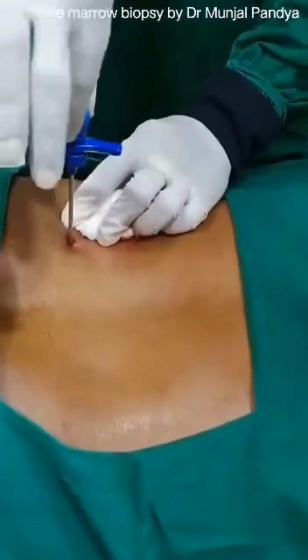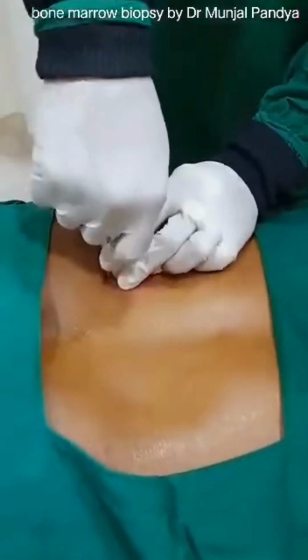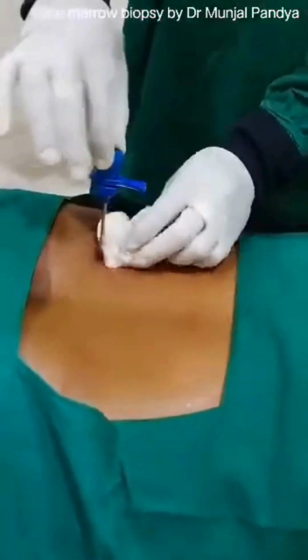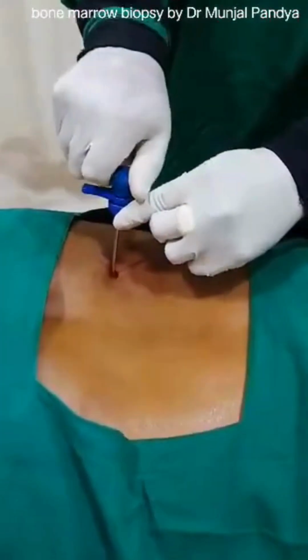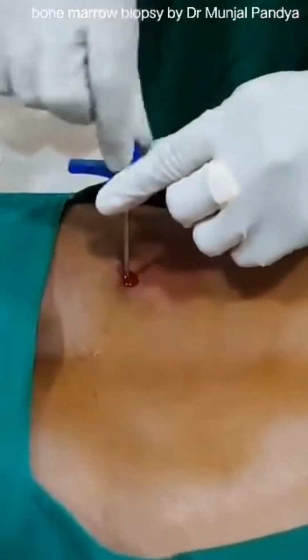Once it is in the bone, you can get the hard feel, right? If it is loose in the soft tissue, it will be out. So it's okay, it's in the bone, so it's a firm hard feel. Now we have to remove that inside part of the bone marrow needle, from where we are going to suck the material, that is aspirate.